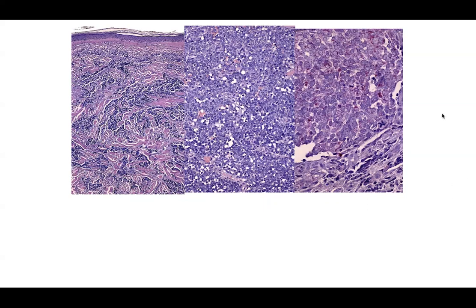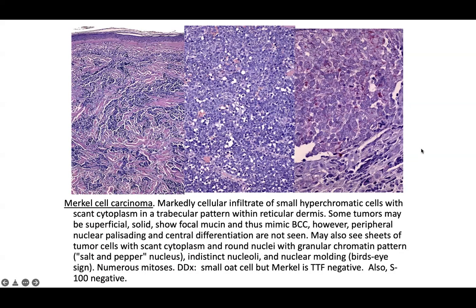Note this really impressive enlarged atypical mitotic figure. This is a Merkel cell carcinoma — markedly cellular with a sheet-like growth pattern in most cases, but it can also show interstitial or trabecular growth patterns.